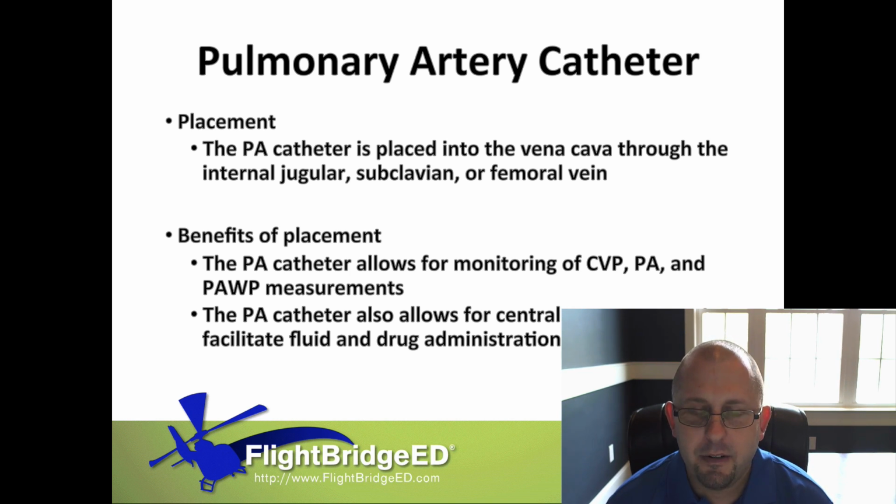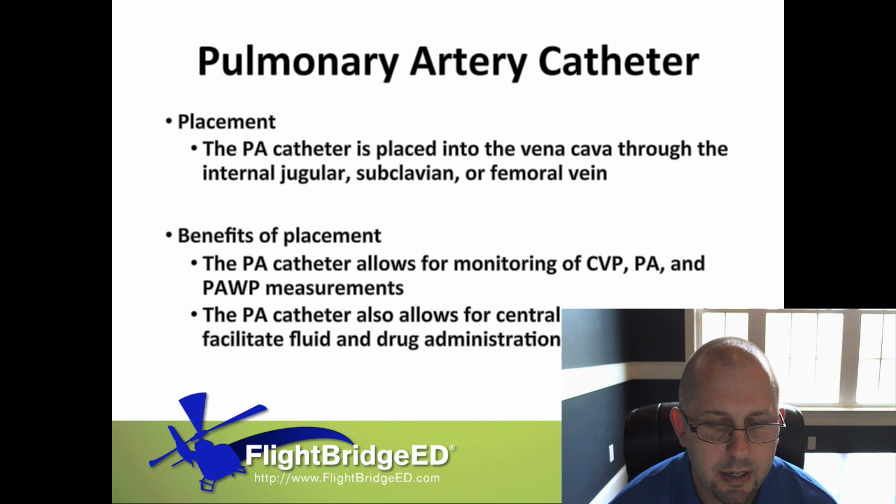And then the catheter on the central venous side, those proximal injectate and proximal infusion ports, is where we're going to give fluids, medications, drips, and things like that, TPN. Now let's look at a demonstration on how this is utilized.